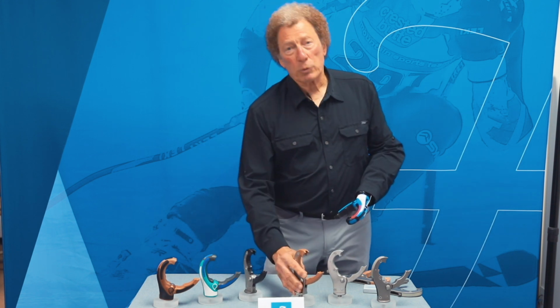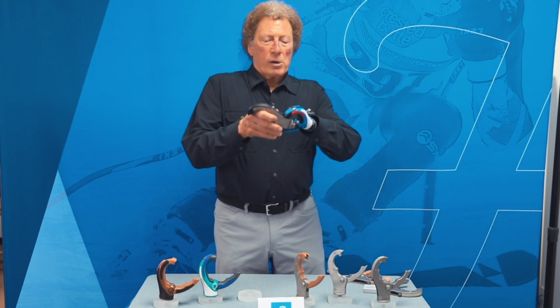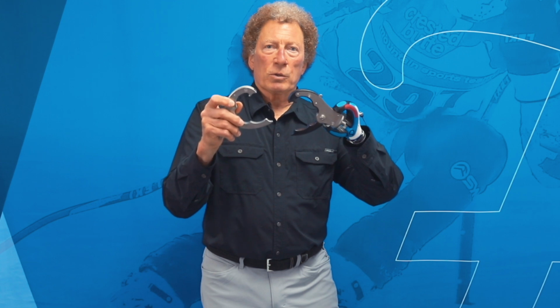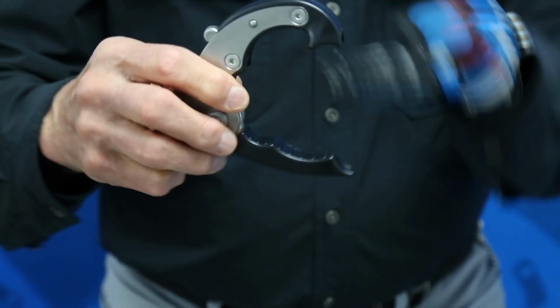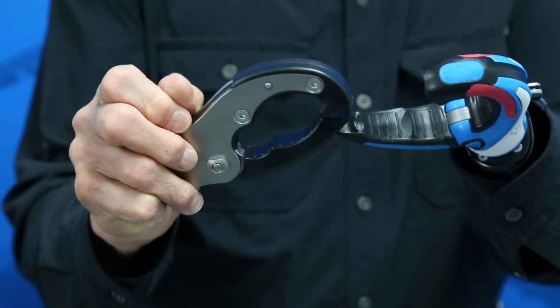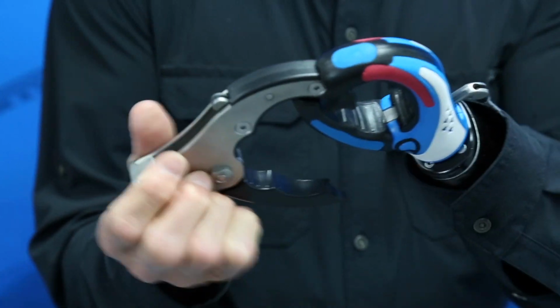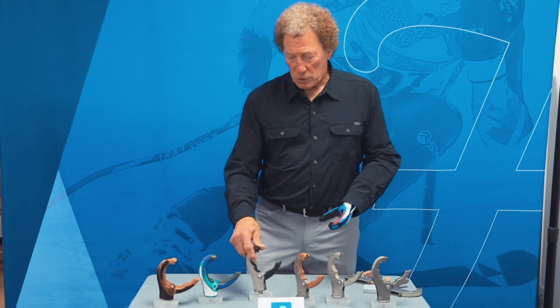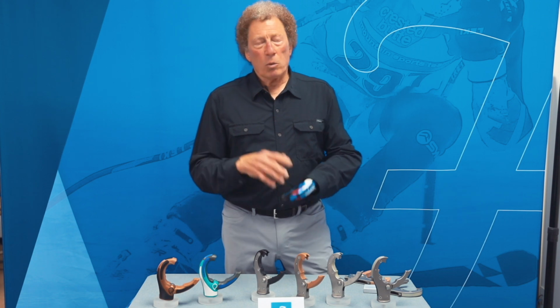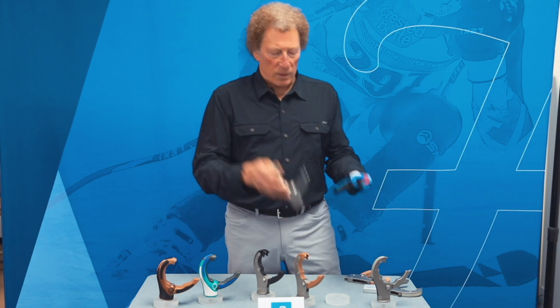And the thing about the Grip 3 that's important over the Grip 2 devices is that this will tear stuff up. It's a heavy-duty tool, but it does do its damage to handles and things like that. The Grip 3, because of these surfaces, is a lot more forgiving. Still very, very functional, same cooperating gripping surfaces, but it doesn't mar objects like the Grip 2 or the Grip 2 SS will. And many people who are using these grip devices that like voluntary closing will own multiple devices. So they might have a Grip 2 that they use in their vocation if they have a heavy-duty vocation.